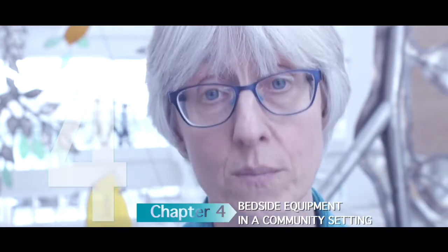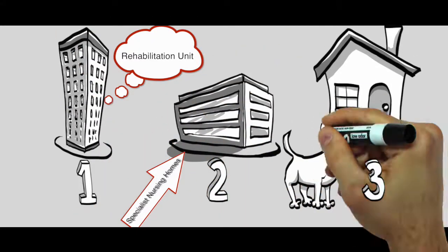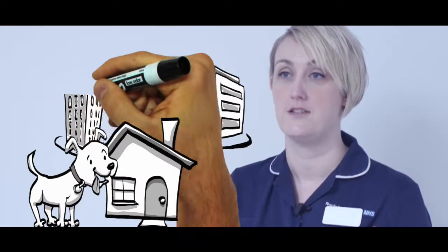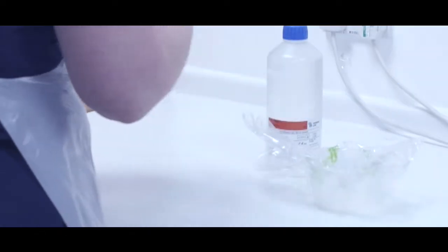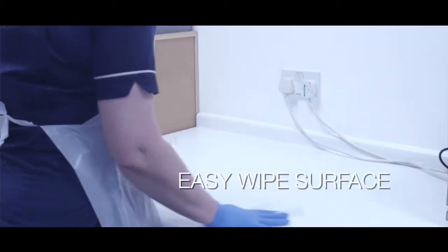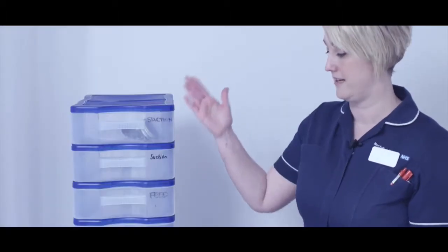Chapter 4: Bedside equipment in a community setting. People with tracheostomies may be discharged to one of three settings: a rehabilitation unit, a specialist nursing home, or their own home. The bedside equipment used in each of these places will look broadly similar to that used in the acute hospital but may look slightly different. Wherever the discharge destination, it is essential that a cleanable work surface is allocated for day-to-day tracheostomy equipment — this could be a clinical trolley, a wipe-clean table, or an easy-clean storage system such as a stack of drawers, which can be purchased from a high street store.